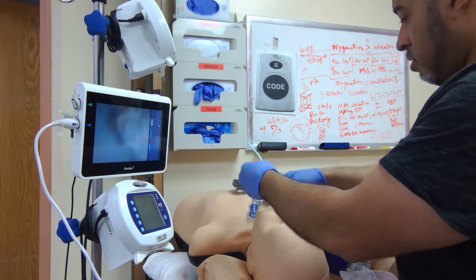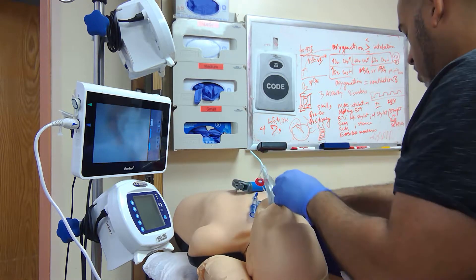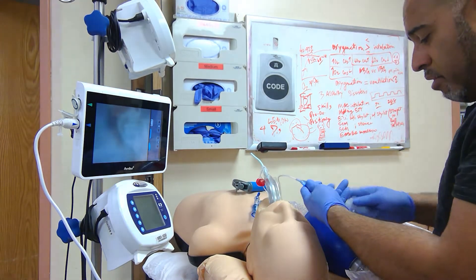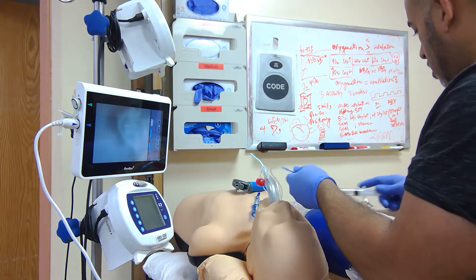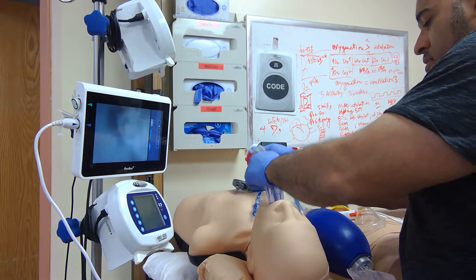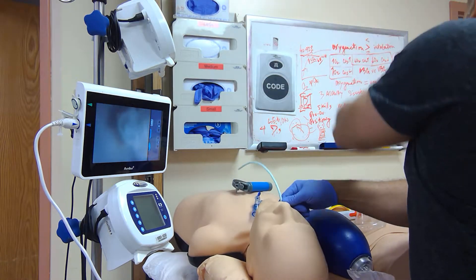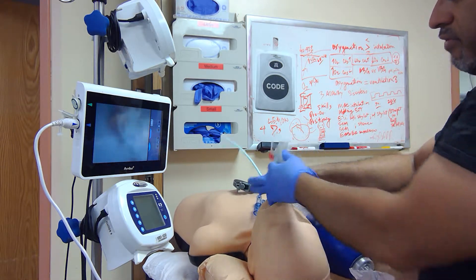Right main stem with the coudé tip down — it's hitting the carina. You can compress your intubating LMA. Take everything out, advance your bougie, grab onto your ET tube. Your bougie is your guide — make sure it doesn't fall out.